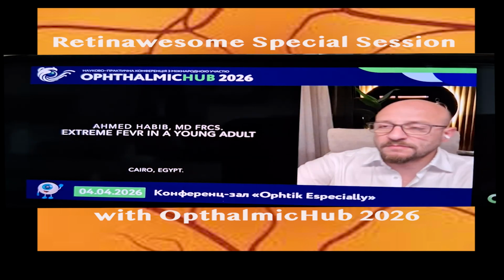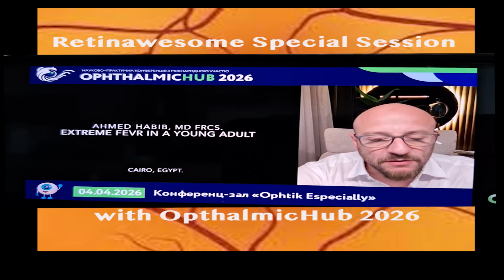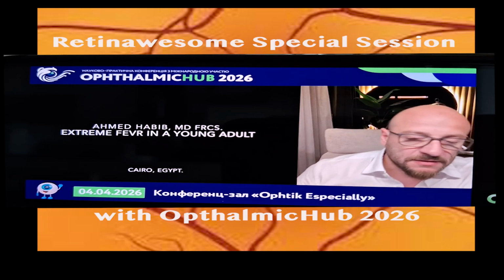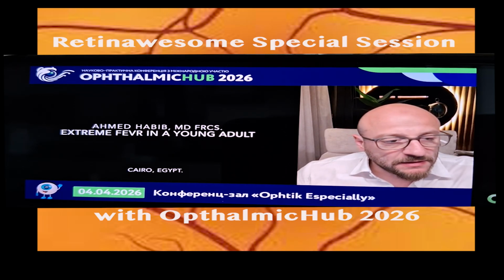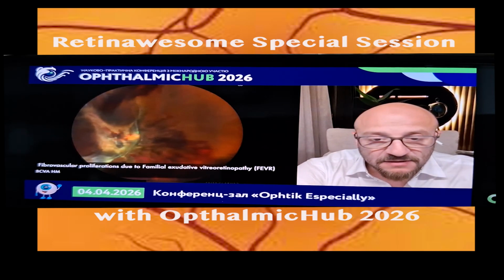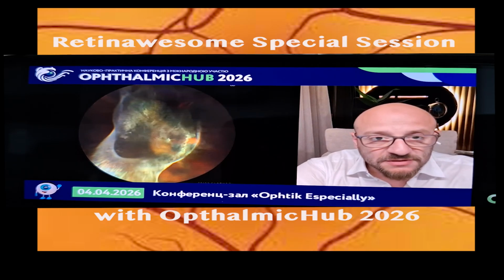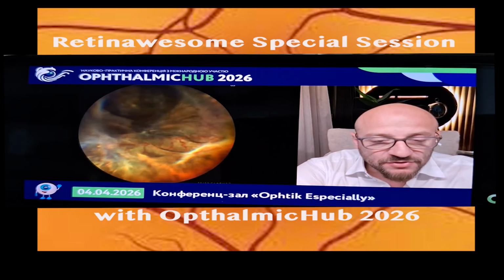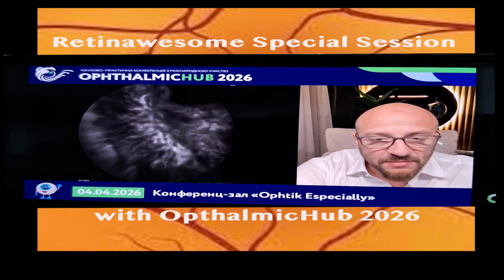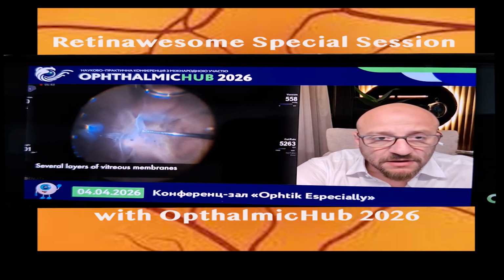Okay, it's on. This is an extreme case of familial exudative vitreoretinopathy in a 16-year-old young lady. This is one of the most severe cases I've seen in this age group with familial exudative vitreoretinopathy. This is the right eye. The vision was hand motion, and this is the left eye, which is nearly lost with PL, bare projection. So I decided to give a chance to the right eye.